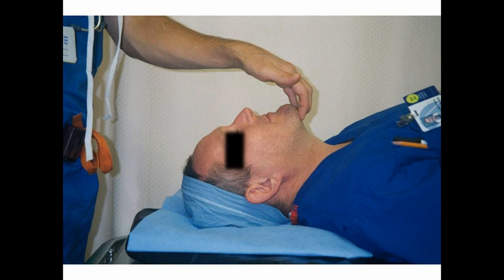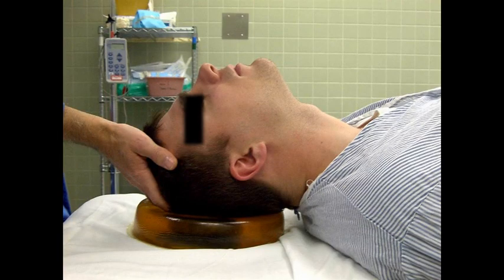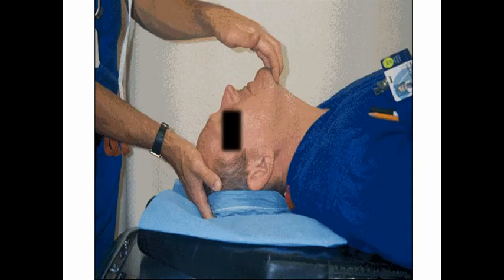Maybe these same maneuvers will be successful in opening the airway enough for us to actually see down the airway and visualize the larynx when we perform laryngoscopy. The first maneuver then will be the chin lift maneuver. The second is head extension, and immediately prior to intubation, experienced providers often do these two maneuvers simultaneously, with the left hand lifting the chin and the right hand positioning the occiput.